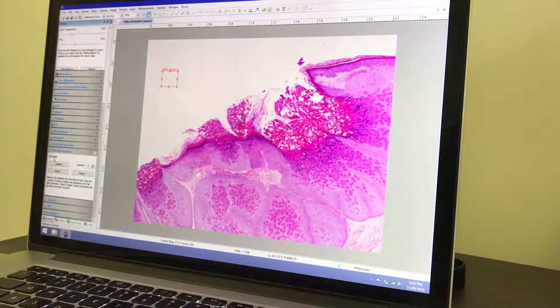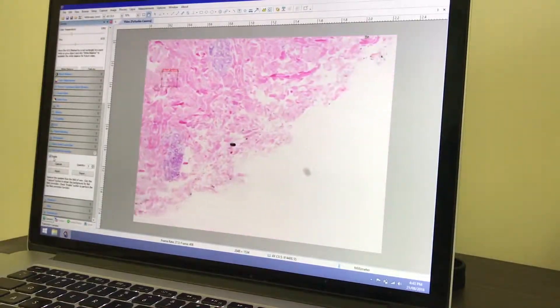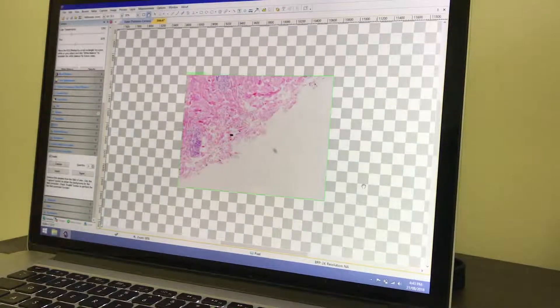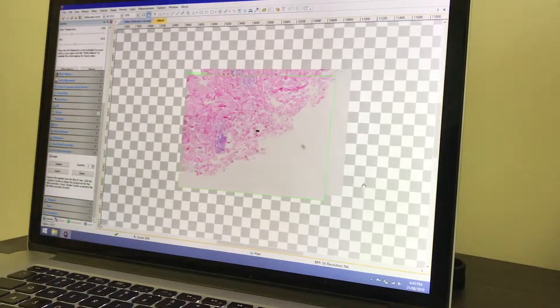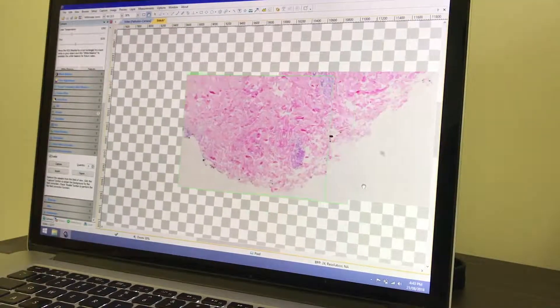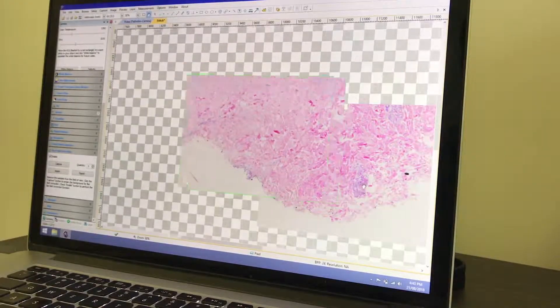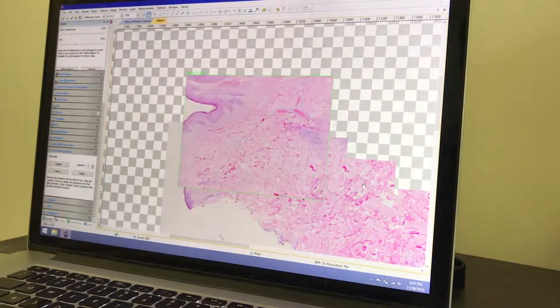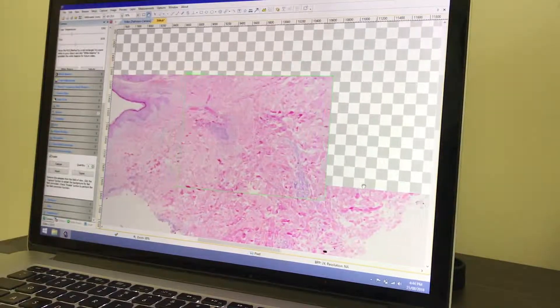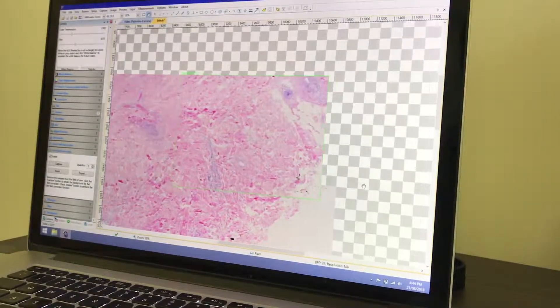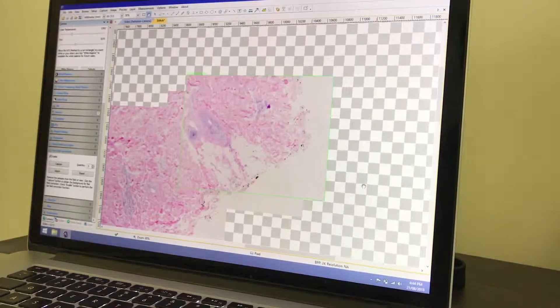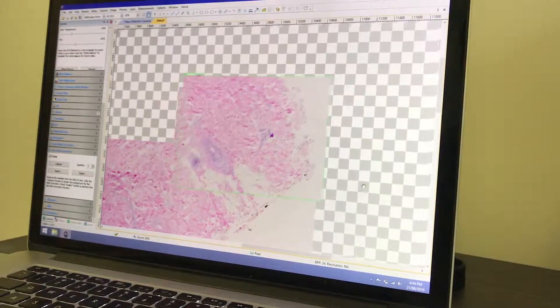Now we're ready to stitch. Just click the Stitching Shortcut button from the top menu bar and the process starts. It's best to begin from one corner of the tissue and systematically move the microscope stage back and forth, and up or down in rows, to cover the entire area of tissue. Because I started in the bottom corner of this specimen, I'm moving up with each row.